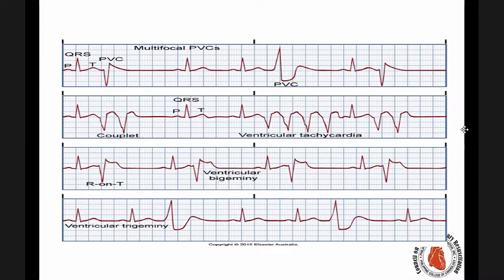When we say sustained versus non-sustained, a ventricular tachycardia of more than 30 seconds is a sustained ventricular tachycardia. If it is less than 30 seconds, that is a non-sustained ventricular tachycardia. Two PVCs in a row is called a couplet, premature ventricular contraction. But once it becomes three premature ventricular contractions, hindi siya triplet PVC; we will call it a non-sustained ventricular tachycardia. In this particular example, apat na sila na sabay-sabay, we will now call it a ventricular tachycardia.